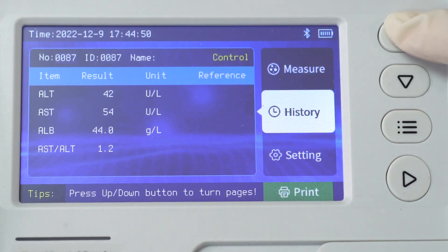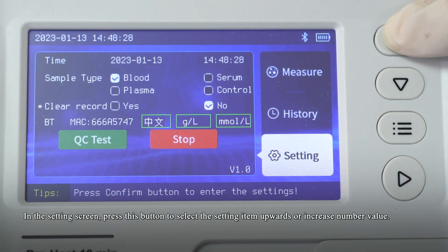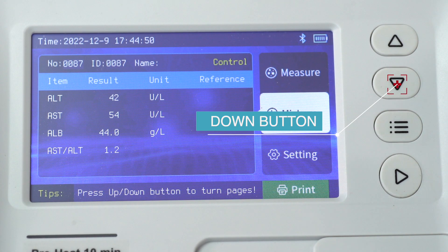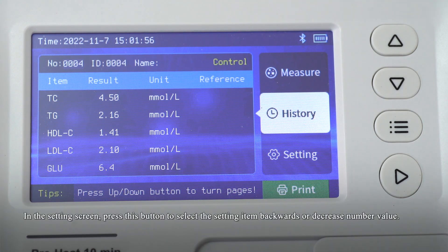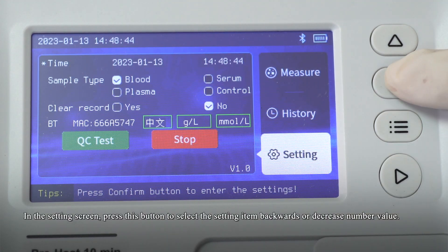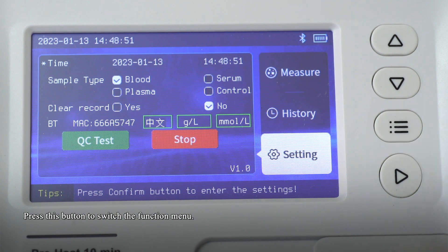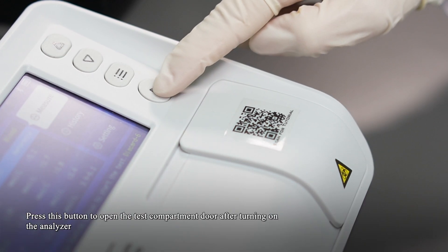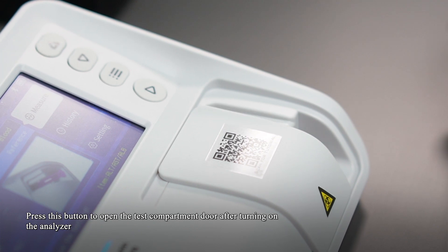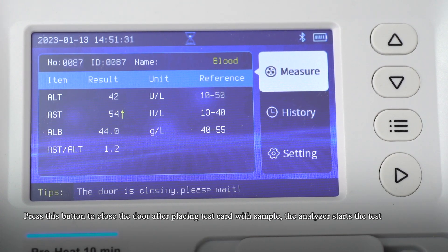Up button: In the history screen, press this button to view the history forward. In the setting screen, press this button to select the setting item upwards or increase the number value. Menu button: Press this button to switch the function menu. Open/Close/Confirm button: Press this button to open the test compartment door after turning on the analyzer. Press this button to close the door after placing the test card with sample. The analyzer then starts the test.